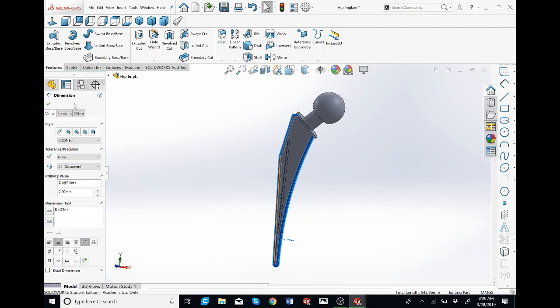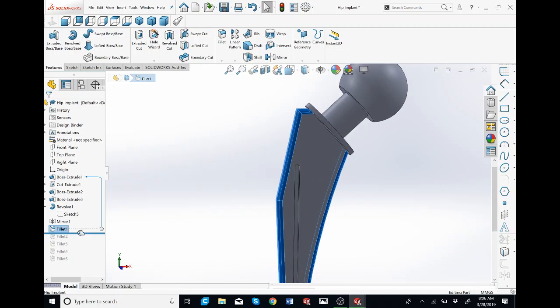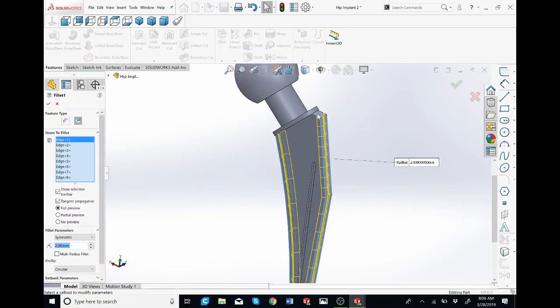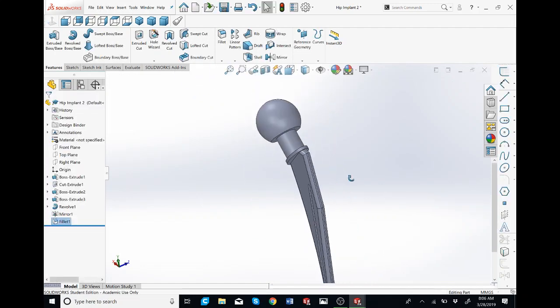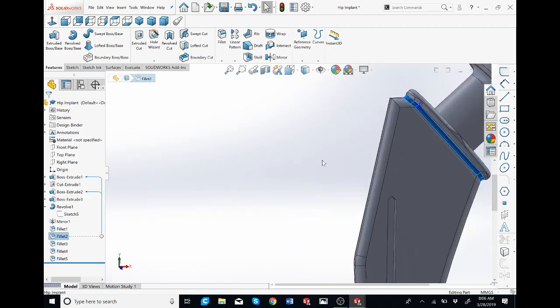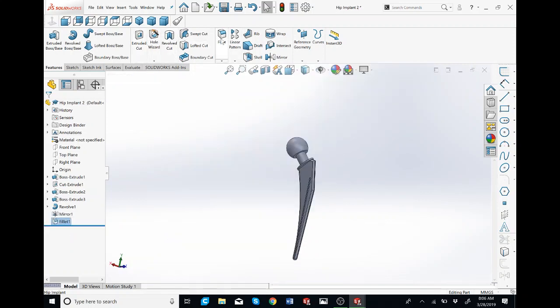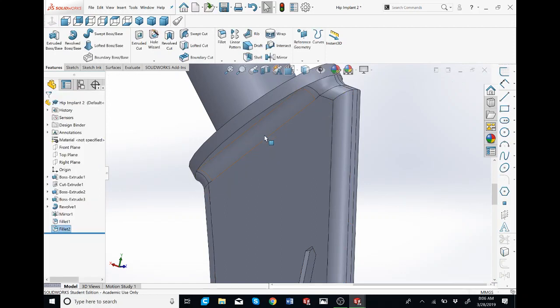I'm going to go over to the next. I missed a couple edges here, so I'll revise that real quick. I'm just going to roll this all down so you see what it looks like. Can just edit this, click on this edge, and this edge. Yep. So for the next one, you can see I just made a fillet over here. It's going to go in, fillet, that, and I'm just going to right click just to check it off.